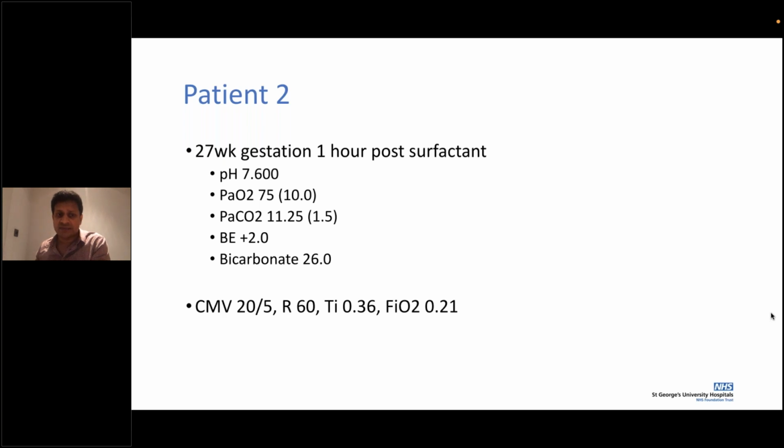It's just that if the baby is breathing above 60 and your backup is 60, you may not necessarily know how much additional backup rate is needed. So the good strategy: volume control, reduce that rate, put it on PTV mode of ventilation, get a normal gas, and plan towards extubation if the baby is otherwise all right. Are you happy with that explanation so far?